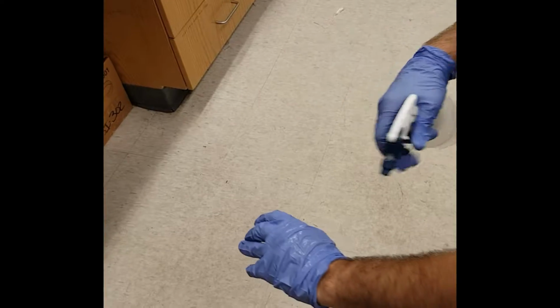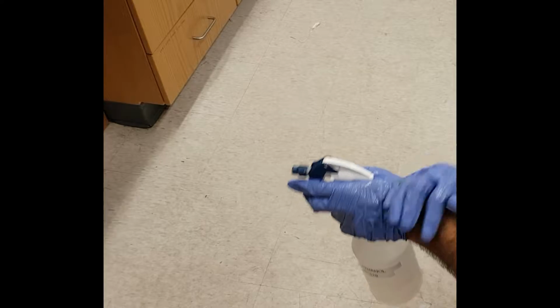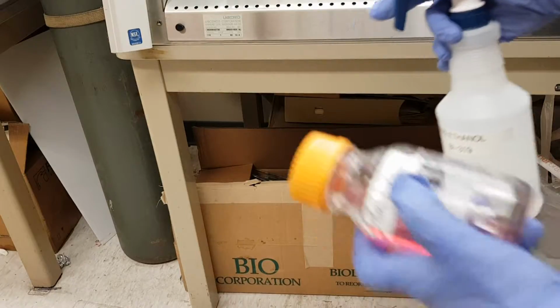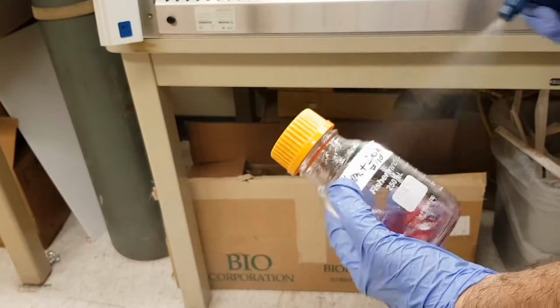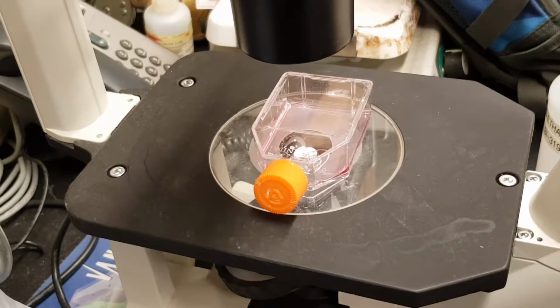When conducting the passaging cells technique, make sure to follow strict aseptic technique. This includes disinfecting the interior surfaces of the flow hood with 70% ethanol, as well as anything else you place into it. Visually assess confluency of the flask.